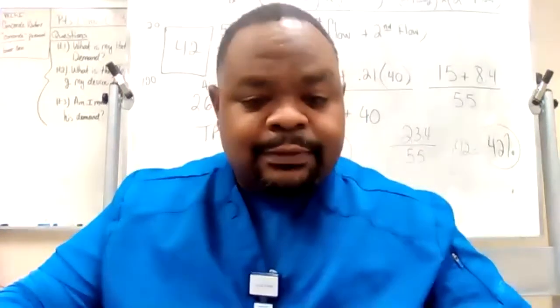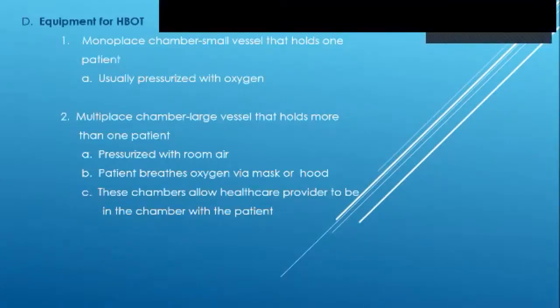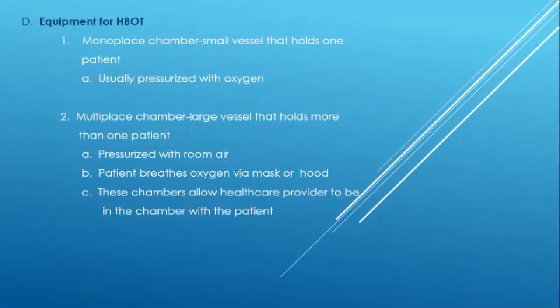Hyperbaric equipment. So we have the monoplace chamber and the multiplace chamber. The monoplace is simply that: one person gets in there. If only one person gets into the monoplace, then it is pressurized with oxygen.